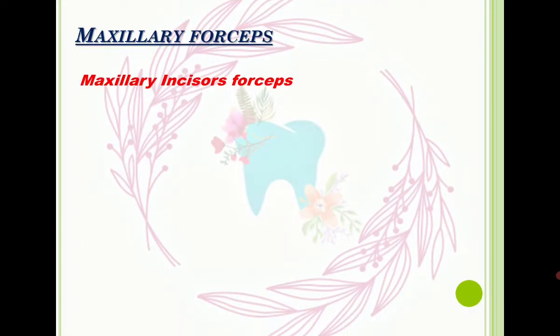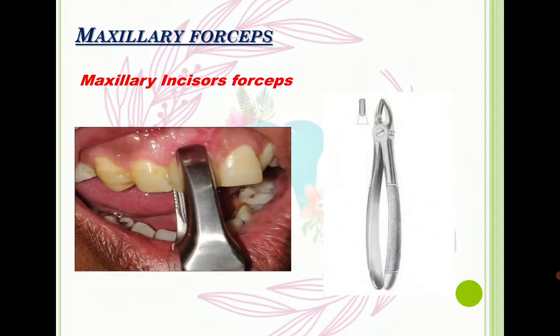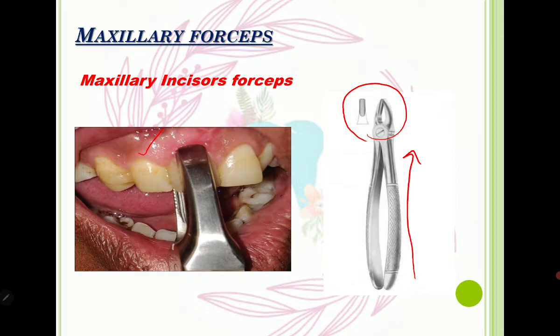Now let's check maxillary forceps. First, the maxillary incisors forceps — they have a straight handle and a working part that we apply to the tooth. You can see here how we are applying the forceps and starting the extraction.